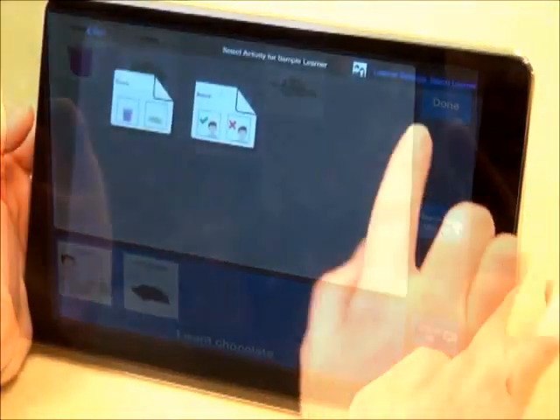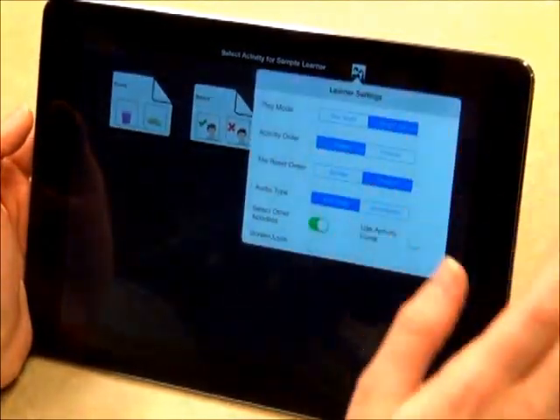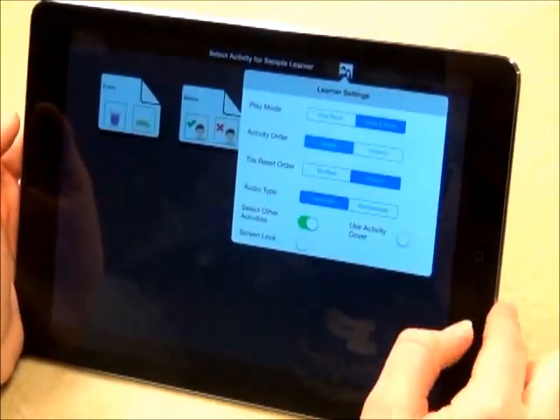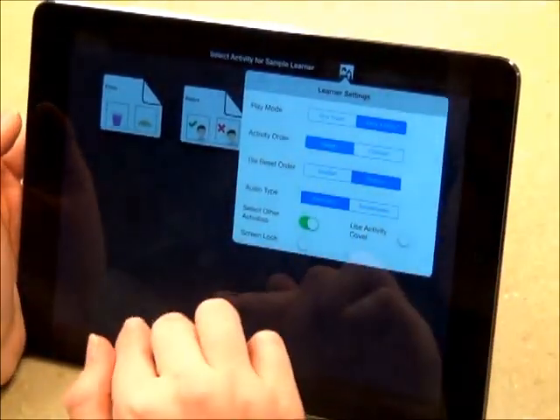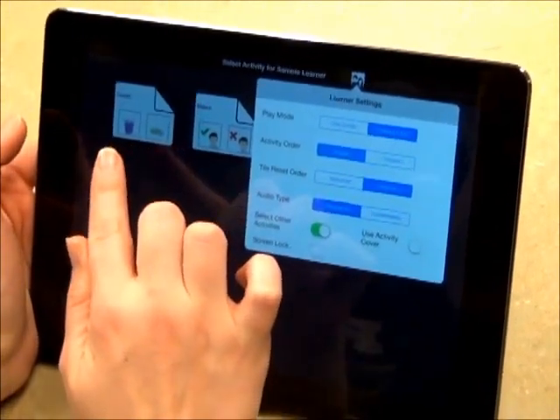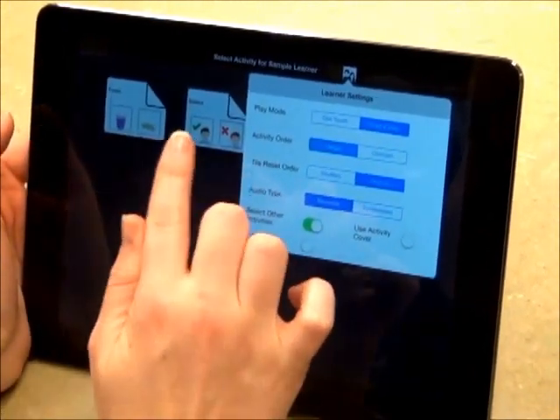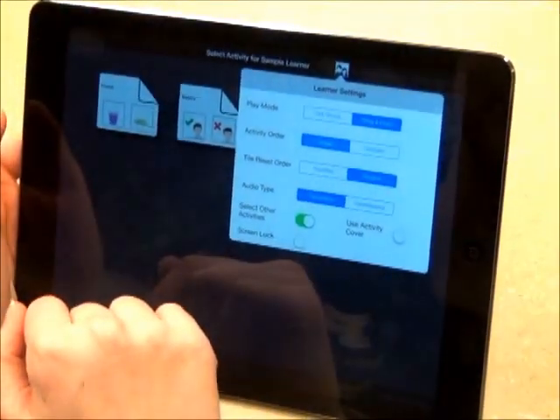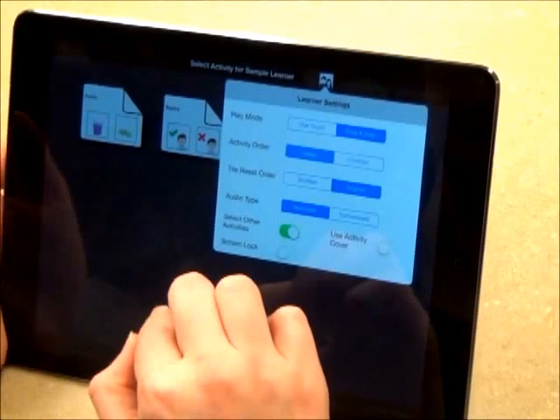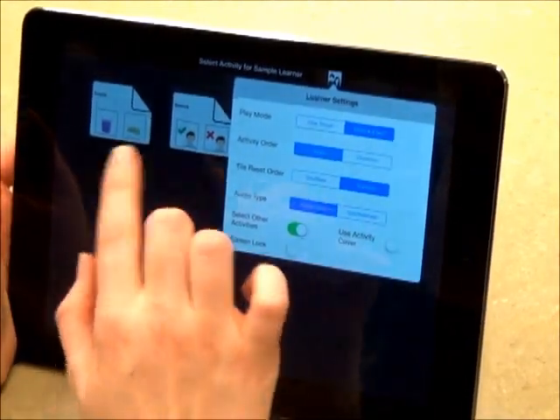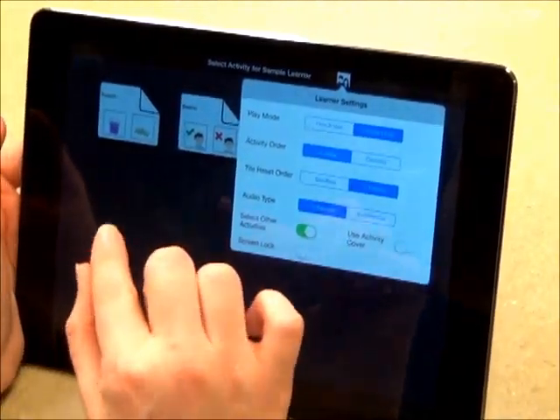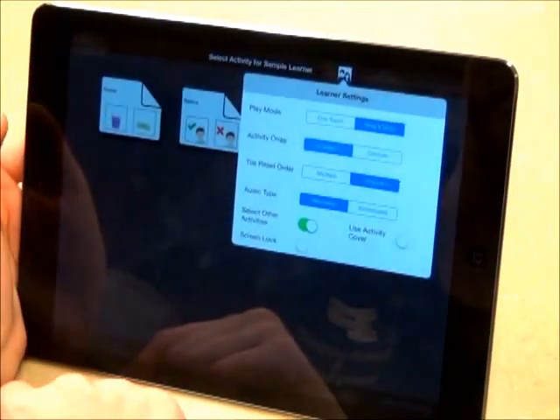The next learner setting is activity order. When usage mode is turned on, the activity sheets are ordered according to which one is used the most. When clinician mode is turned on, they remain in the same spot that the clinician has placed them.